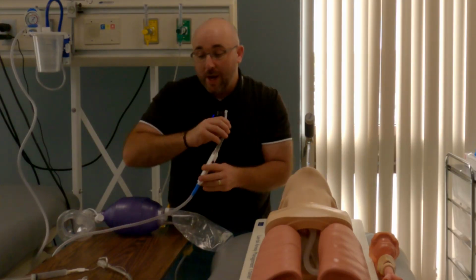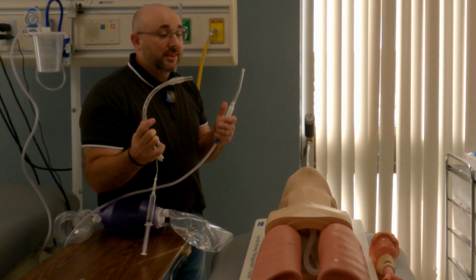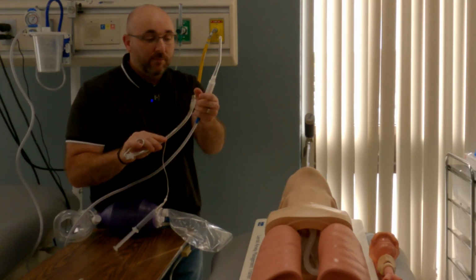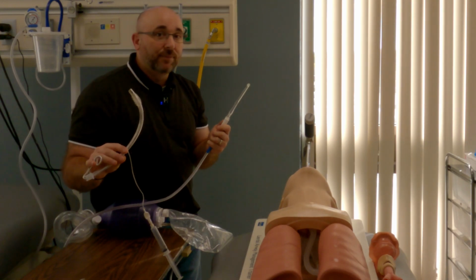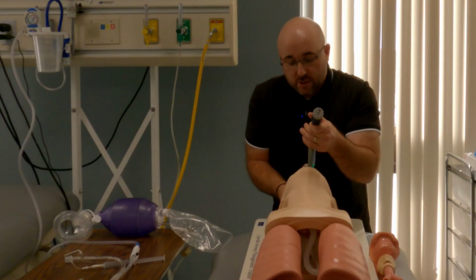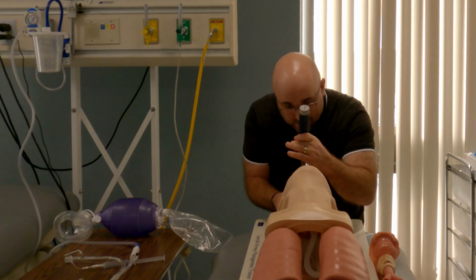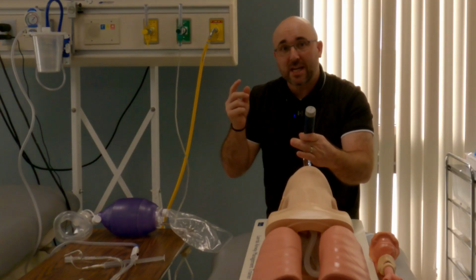So the person that's waiting here, gloved and ready to go, should be ready like this. Endotracheal tube, usually with a package over the bottom half, and then the suction, because the person intubating is going to ask for one of those 2 items. If I go in and I see a lot of mucus, or I see some occlusion, some things I don't want to push down to the lower airway, I may ask for suction.